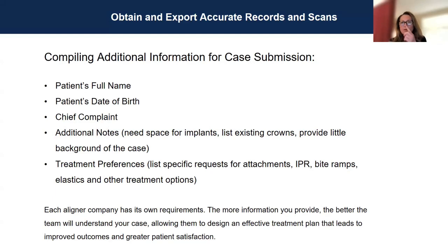It may be off. You want more of an aesthetically pleasing outcome, right? Clinically, I don't understand how, I mean, that's fine with whatever aligner companies say that they don't need any photos, but it's a person, it's not just dentition.